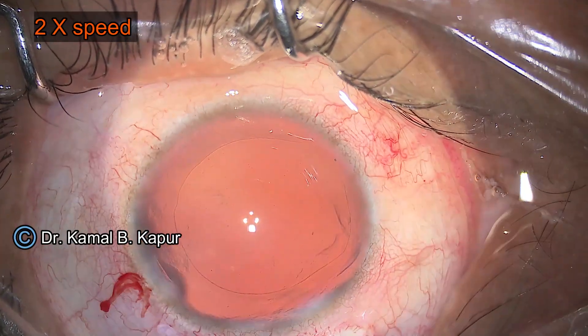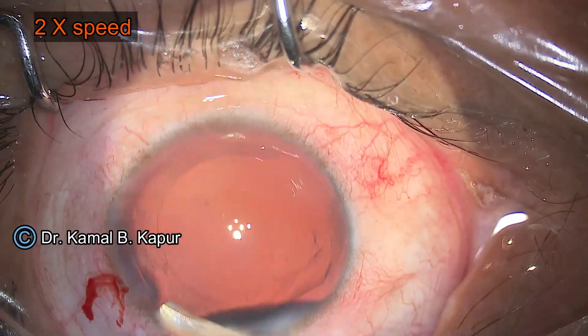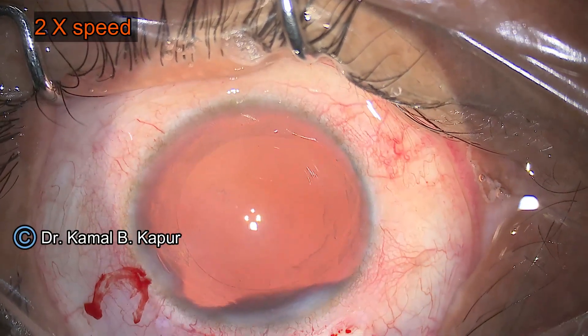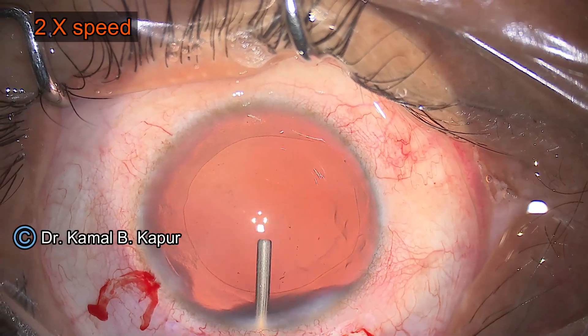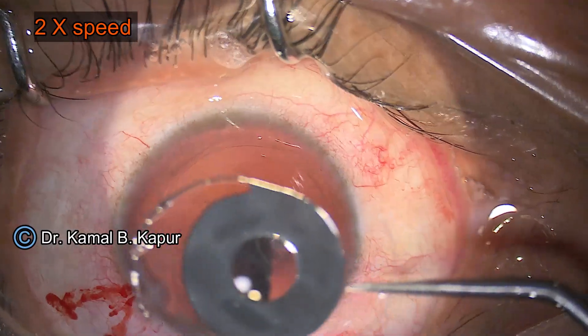This patient was thoroughly examined by our team of retina surgeons with scleral depressors and everything was found to be intact — the patient was found fit for surgery. You will now see me extend the wound with a 5.25 millimeter keratome, which gives a very clean cut when enlarging these wounds. You can also use a crescent blade, but I'm comfortable with this 5.25 millimeter keratome.